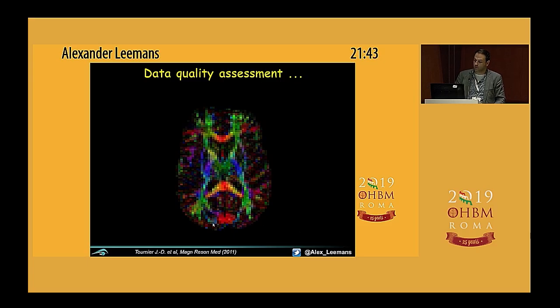If you look at the bottom of the brain over here, we see this red blob, suggesting a direct connection between the occipital poles. Well, it's very unlikely, but you never know, right? So how can I assess that this is an artifact and not something genuine, a hyperplasticity thing? To do that, you can look at the residuals from the model estimation.